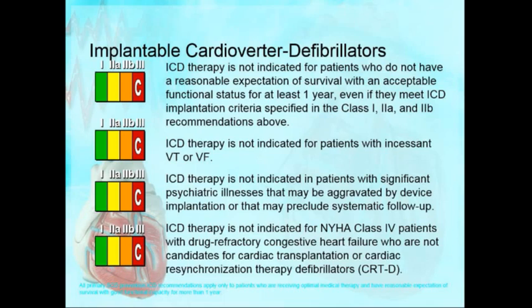Very good. Anticoagulation and antiplatelets. If somebody is on aspirin and Plavix, I never stop it for an ICD. I'll put the ICD in through that.